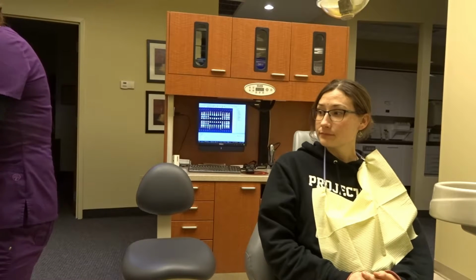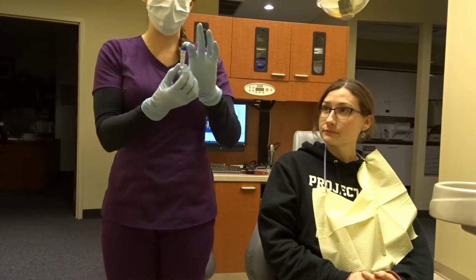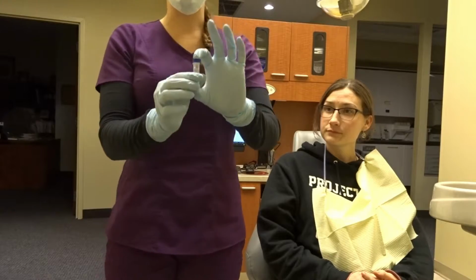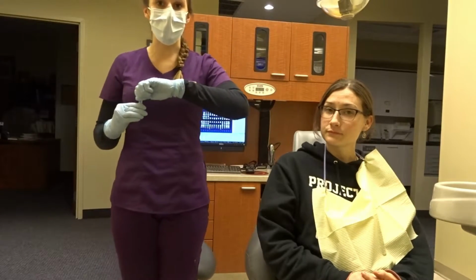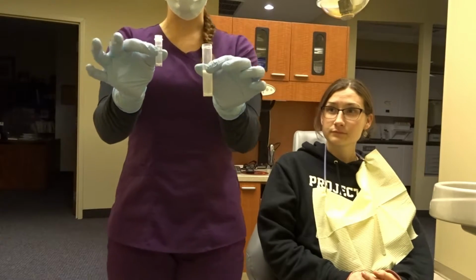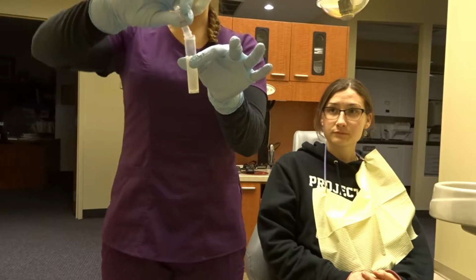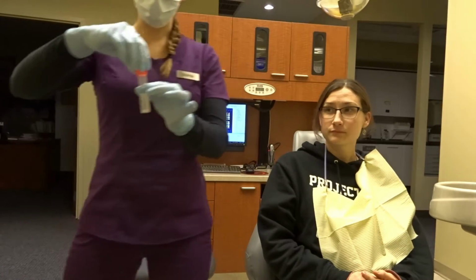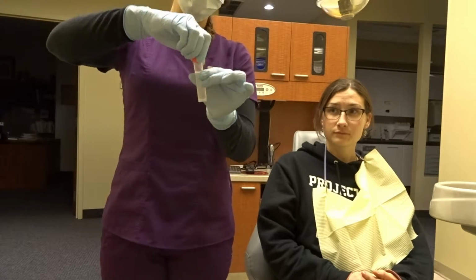And then there is a preservative solution that needs to be put into the tube before you send off to the lab. So you can put the preservative solution into the tube here. And you can close a final time completely.